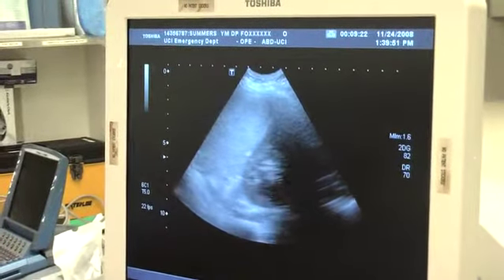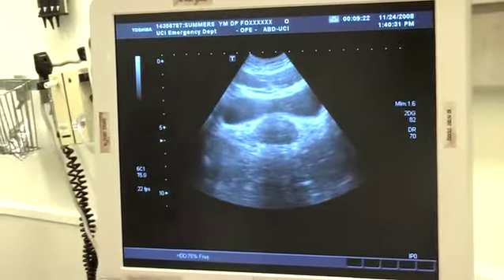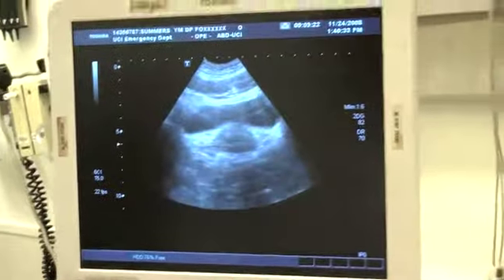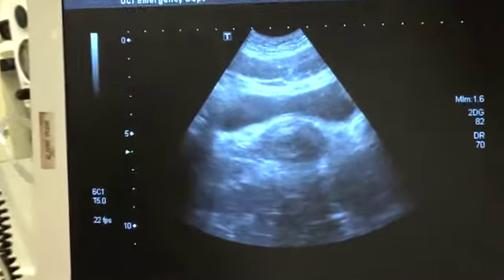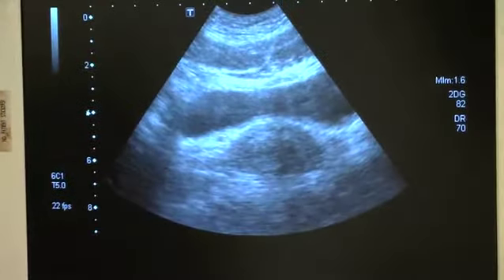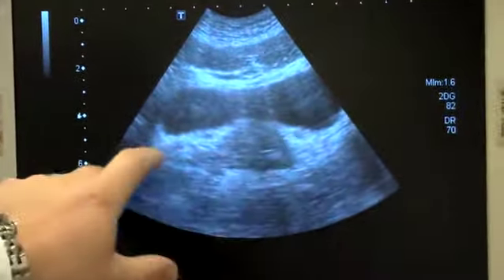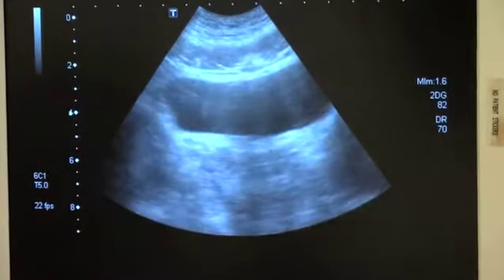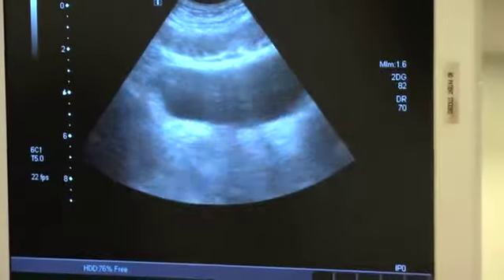Okay. So the next view, the final view, is the suprapubic view. You're looking for fluid in the retrovesicular space. Again, I'm wasting real estate here, a little bit too deep. I'm looking for fluid back here in the space here. I don't see any fluid. Right now, the indicator is to the patient's right. I'm about a centimeter cephalad to the pubic bone, and I've got my probe angled about 45 degrees caudally.